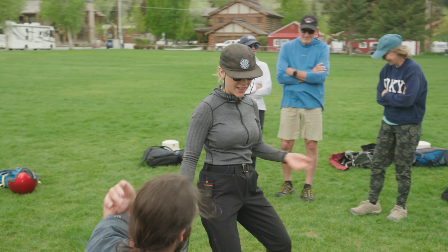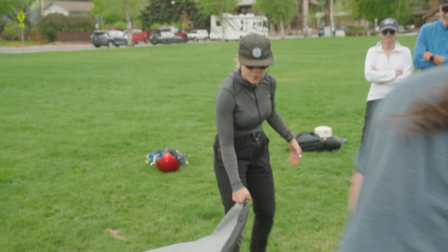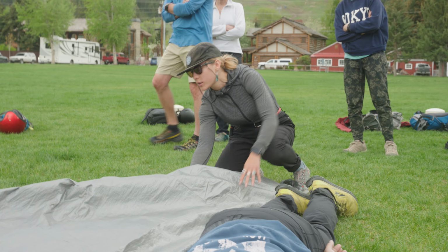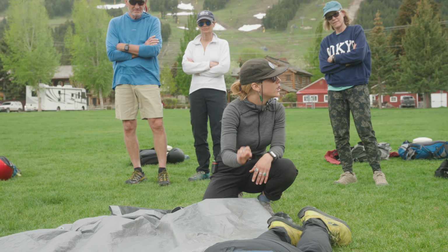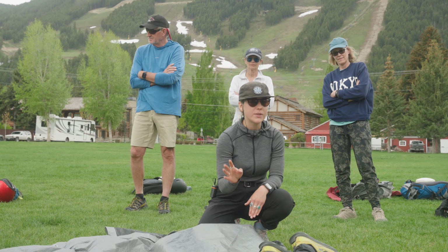That's good. Okay, so now we've gotten our patient kind of decrumpled. Reverse chicken wing, I love it. Now I'm gonna have you pop out of the way here, Kevin. Awesome. Now I'm gonna slide this in towards my patient. Now this is gonna help me as far as environmental management goes. We'll see a lot of reasons why the tarp is helpful.